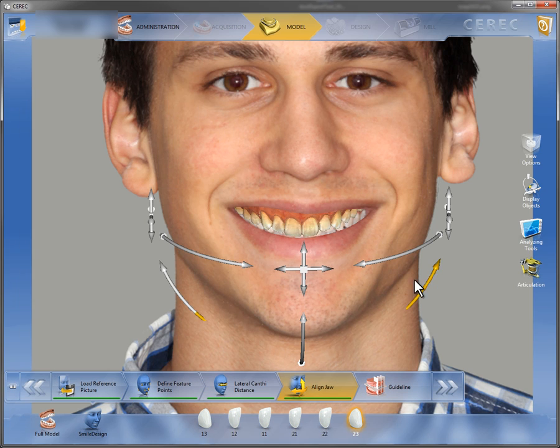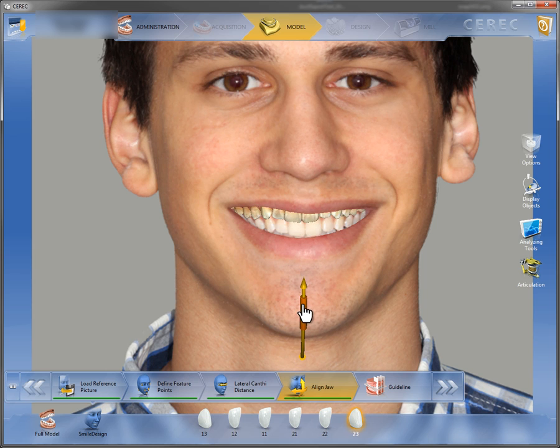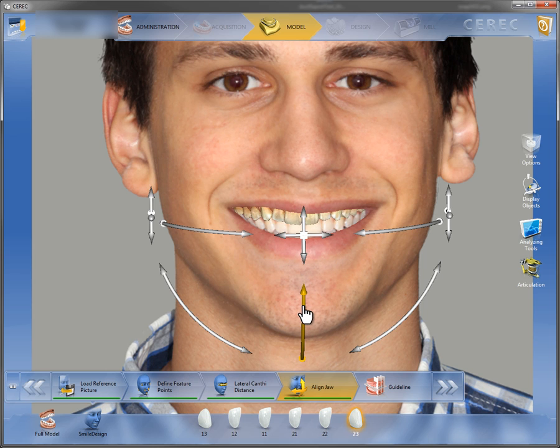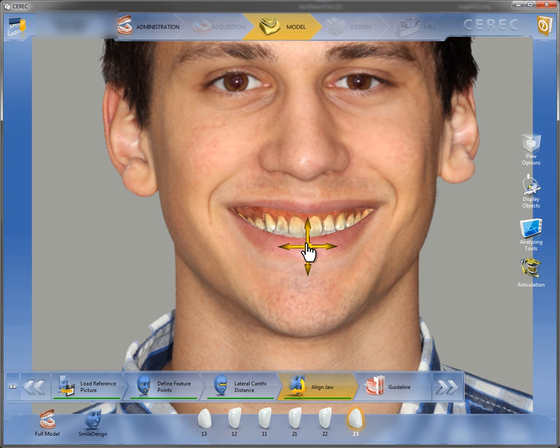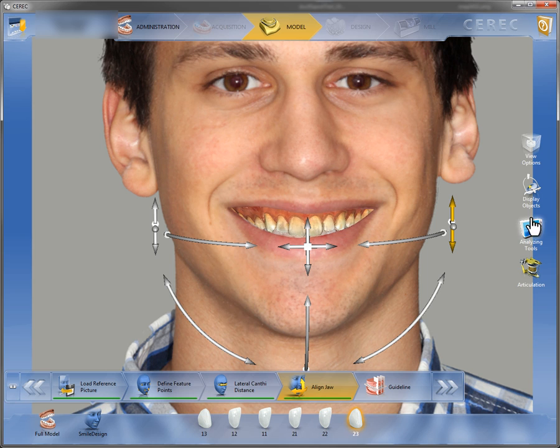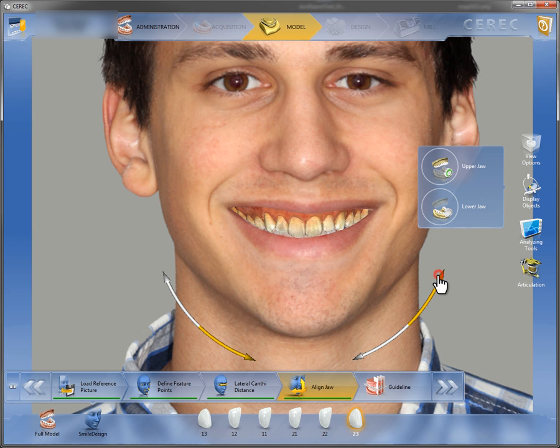The calibration can also be adjusted using this measurement. The 3D model is then shown in the patient context and can be adjusted with the corresponding rotation and translation manipulators so that it covers the patient portrait exactly.